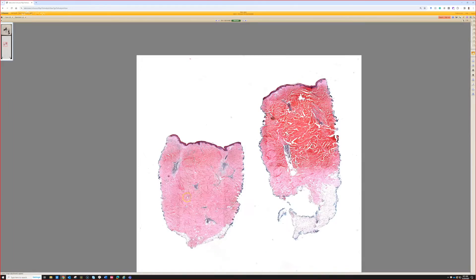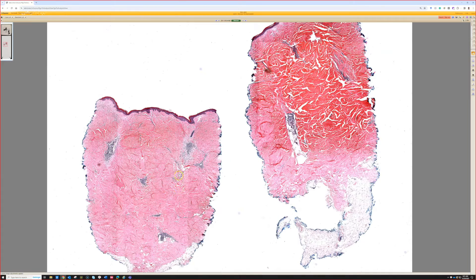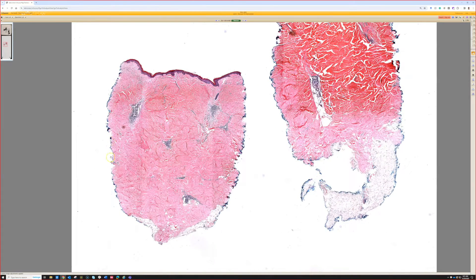Very good. So from low power, people sometimes say this is the square — or more likely rectangle — punch biopsy sign. The punch has this very perfectly squared-off look at the top: the epidermis goes across and then it's straight down. And that's because the dermis is so densely packed with more dense-than-usual collagen. That's a good clue for morphea.